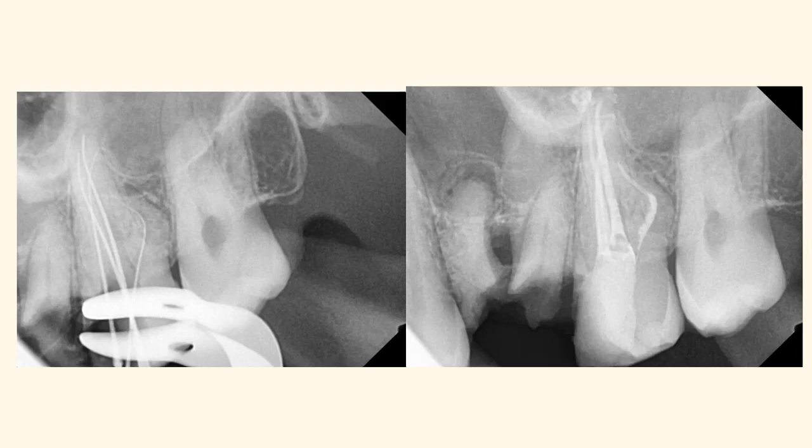Every step in endodontic treatment is important in order to achieve the desired end results. However, creating the correct glide path for the canal you are treating will make each of the following steps in your treatment protocol much easier to perform, resulting in cleaner, well-shaped canals that can be ideally obturated. So, spend maximum time on the glide path preparation.